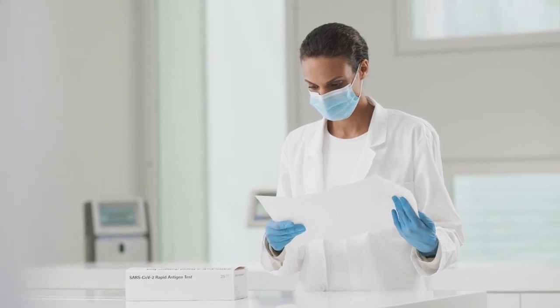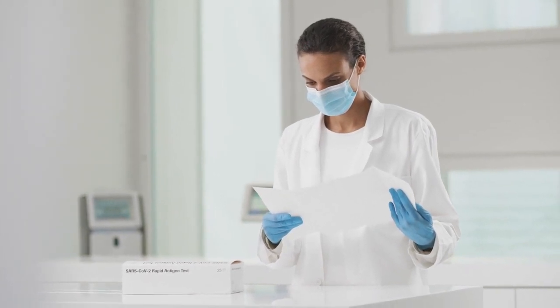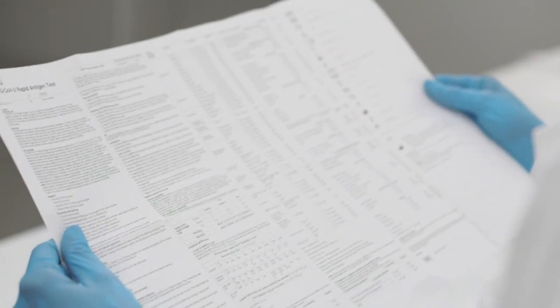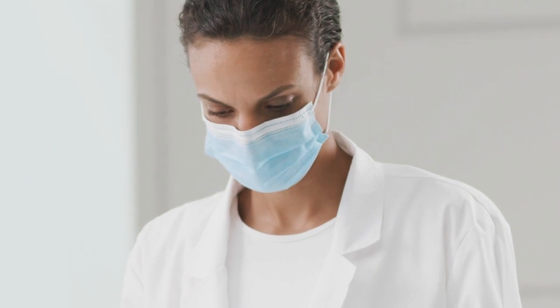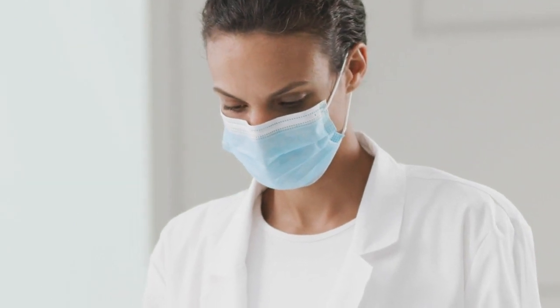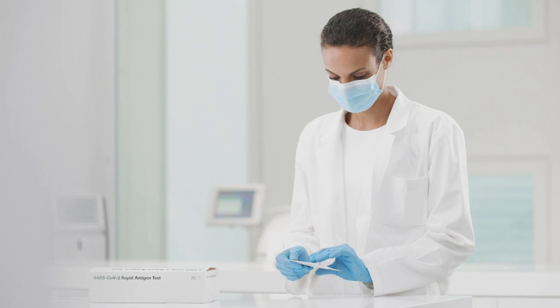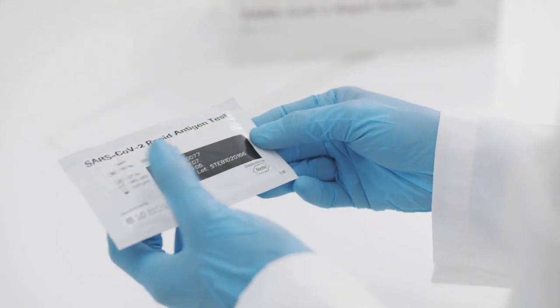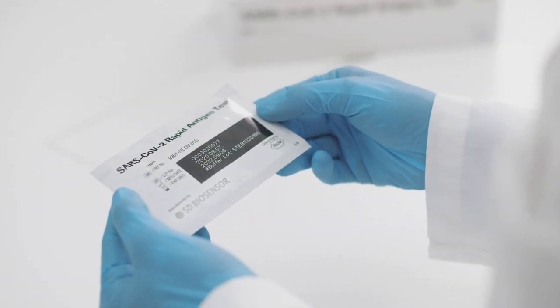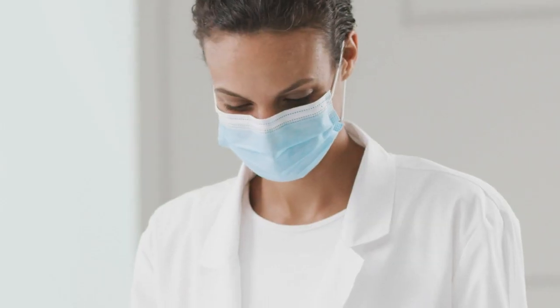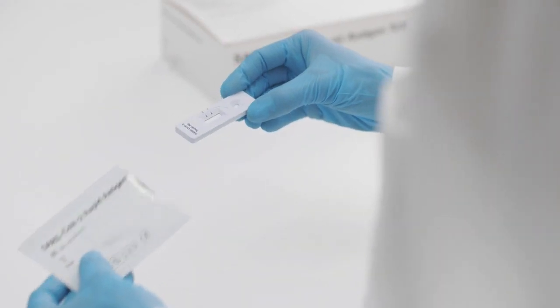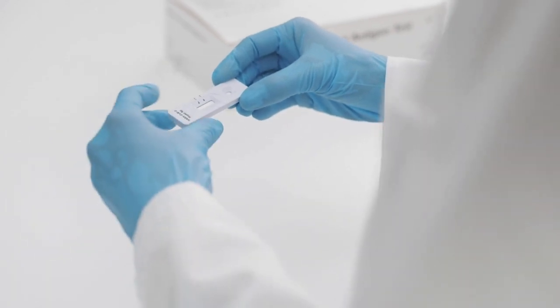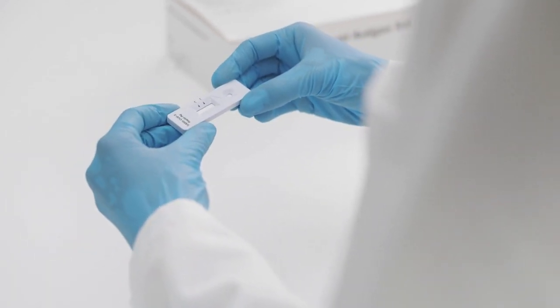There are four steps to performing the test. Begin by carefully reading the instruction for use. Use appropriate personal protective equipment and handle all samples as if they contain infectious agents. Before opening the test, check the expiry date on the back of the foil pouch. Do not use the test if the expiry date has passed. Now open the foil pouch and remove the test device and the desiccant package. Take a moment to ensure that the test device is undamaged and that the desiccant status indicator shows valid.